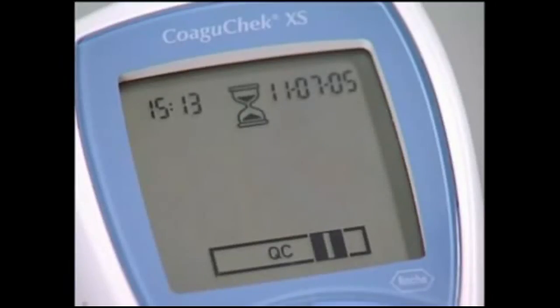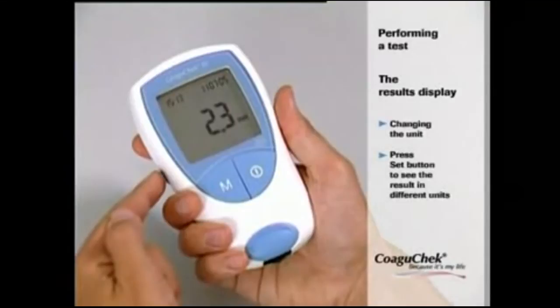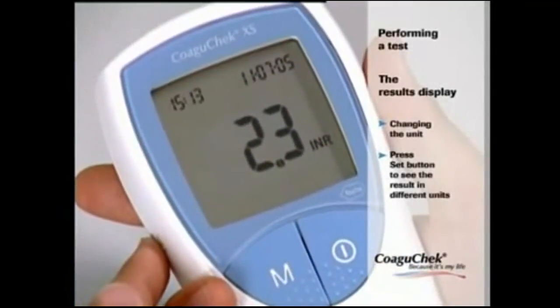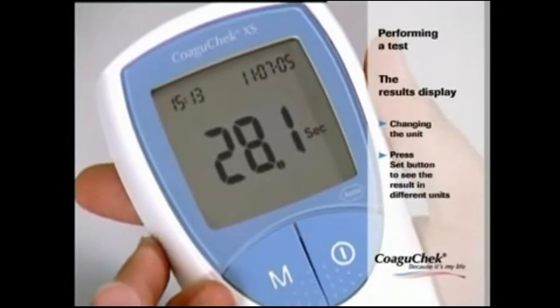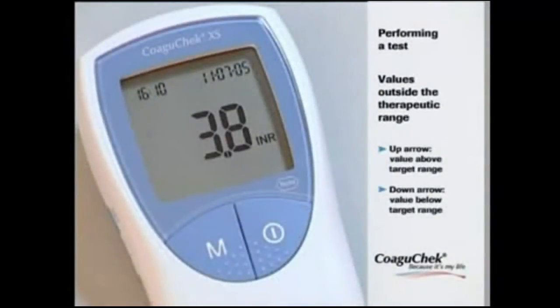The monitor performs an automatic quality control check on the test strip and QC appears on the display. Following a successful outcome, a tick appears after QC and the coagulation measurement begins — the hourglass flashes until the result is displayed. The result is automatically saved to memory. You can change the unit by pressing the SET button; the result is displayed as the INR value, in seconds, or as the quick value. If results are in INR and you have activated the target range option, values outside the range are flagged with an up arrow if too high or a down arrow if too low.